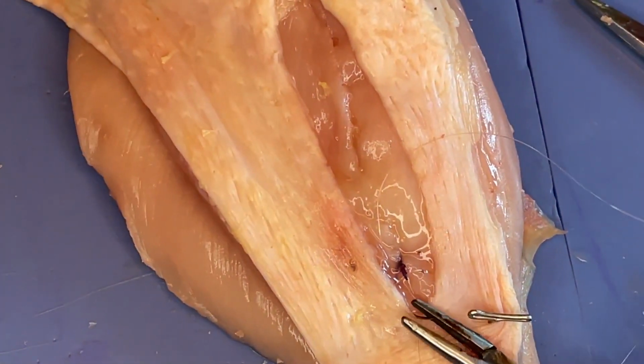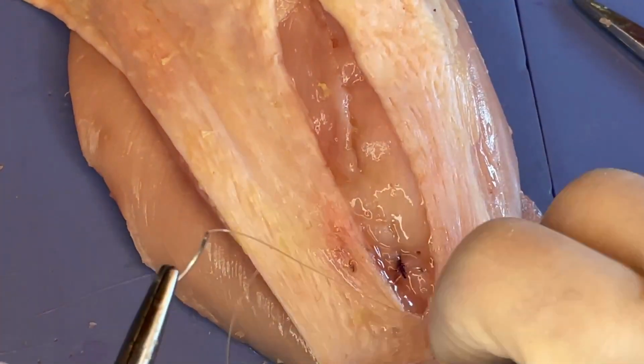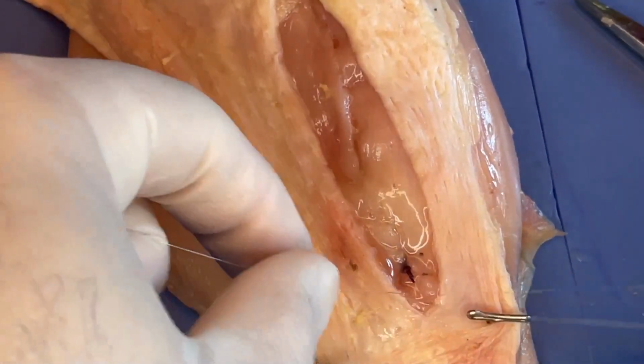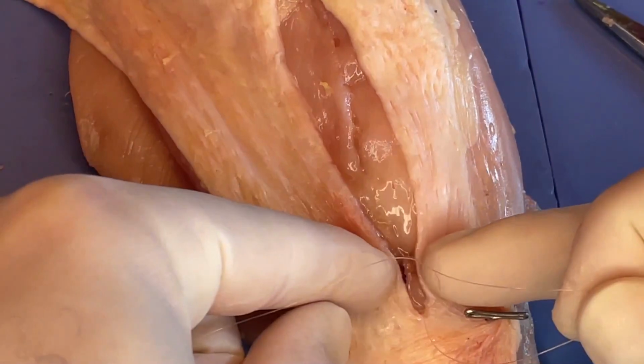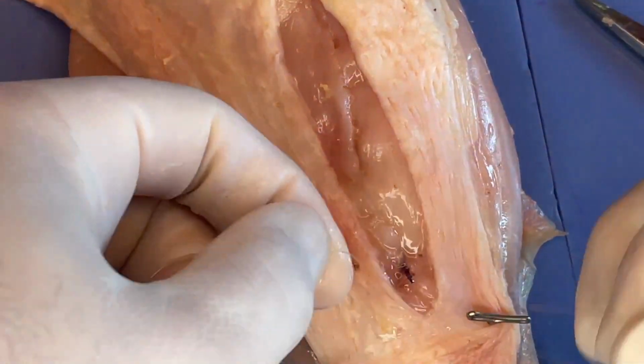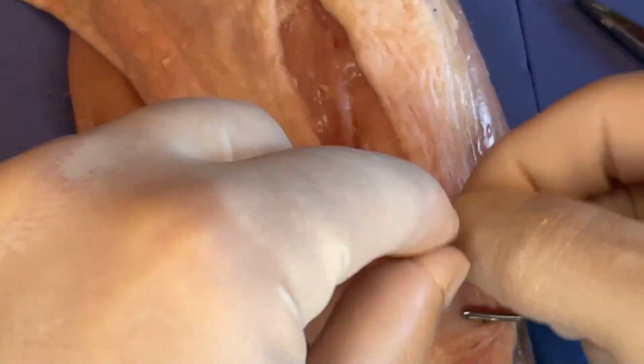All right. So now we've got loop and single strand, and again, if the skin was really connected to the underlying tissue, it would be bringing that edge nicely together. But we can go ahead and tie this.